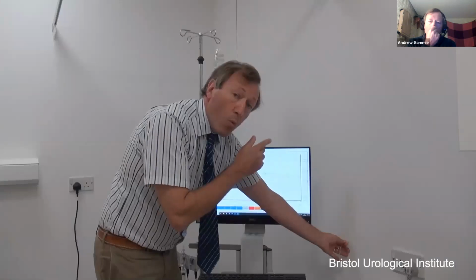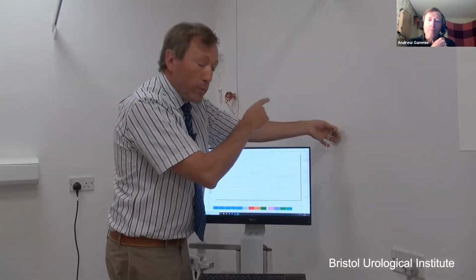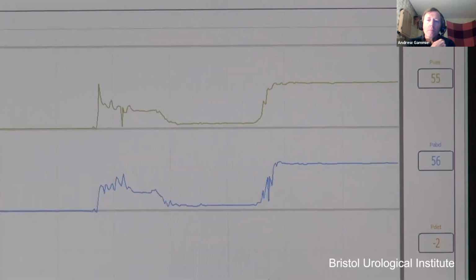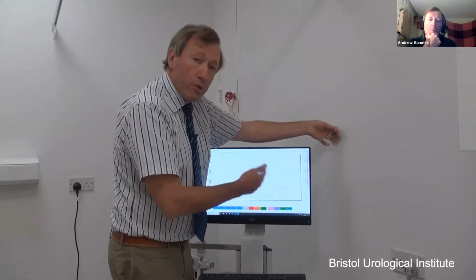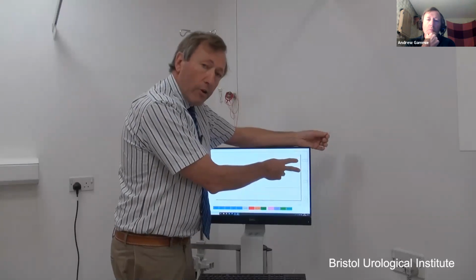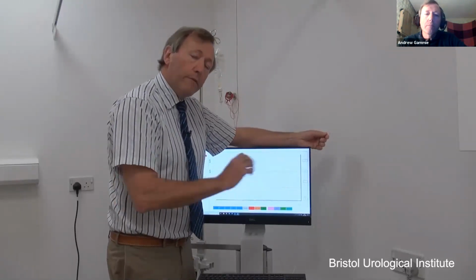So if I raise my water-filled tube up, I should see an additional pressure on the lines, and I've got a marker here that is 50 centimetres above that starting point. And you can see that my pressures here are 55 or 56, which is indeed 50 centimetres above where I started at 6. So I've now confirmed that my system is within calibration, because a change of 50 centimetres height in my water-filled tube gave me a change in reading of 50 centimetres on the screen. My calibration check is complete. I'll make a small note of that in my log so that it is recorded for future reference.